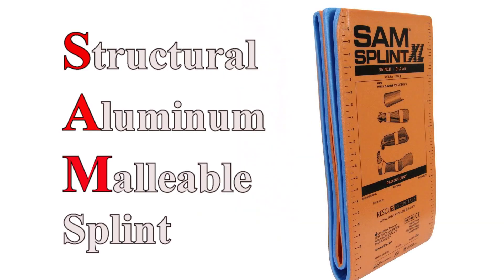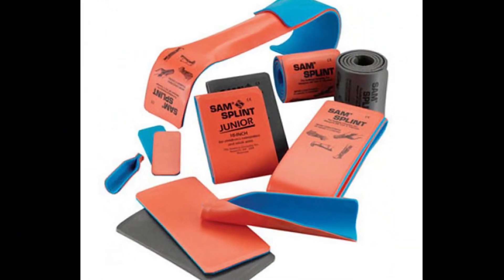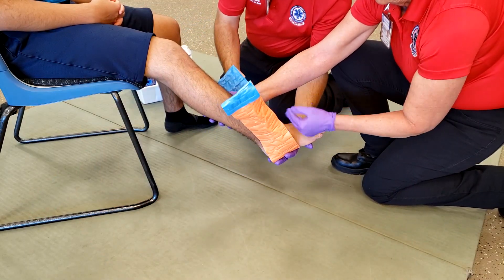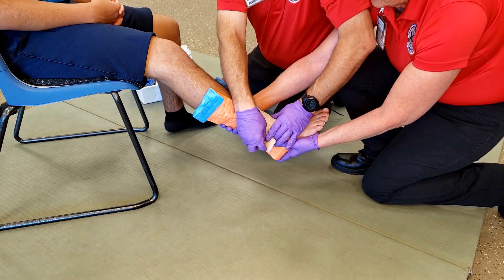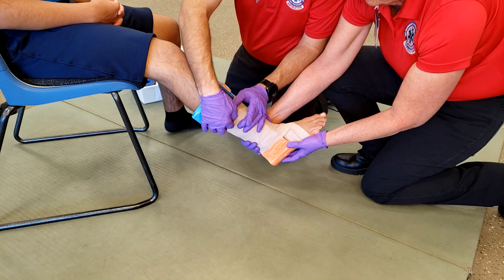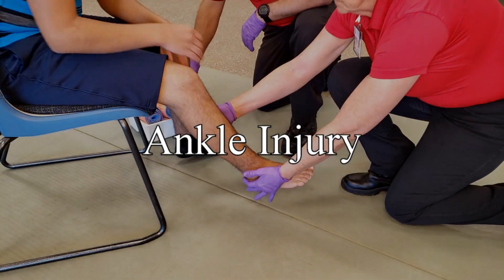The structural aluminum malleable splint, or SAM splint, is designed for immobilizing bone and soft tissue injuries in the emergency setting. It can be unrolled or unfolded and formed to the shape of the injured person's body. Once folded into a curve, it becomes quite rigid and capable of immobilizing a number of different wounds. It can also be easily cut with any scissors or shears to make smaller devices such as finger splints.